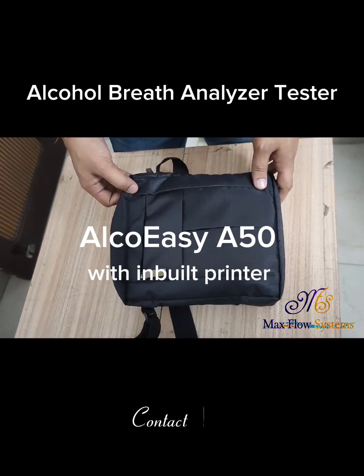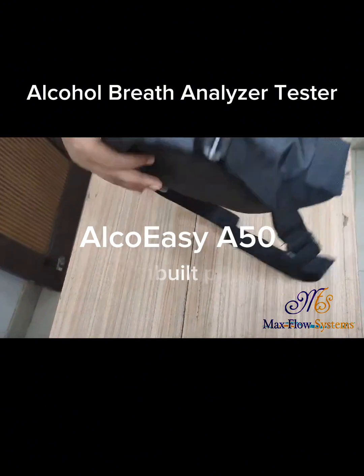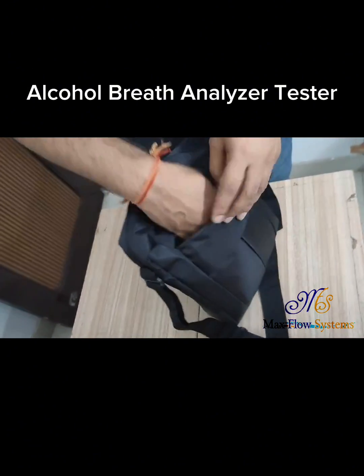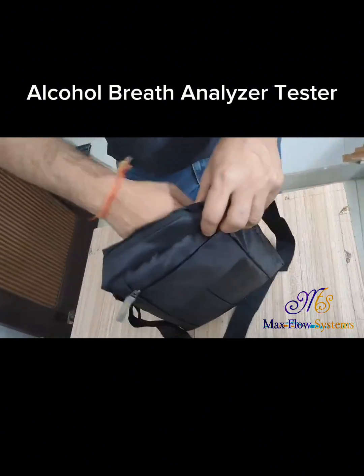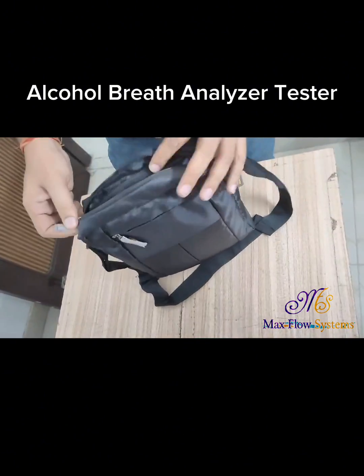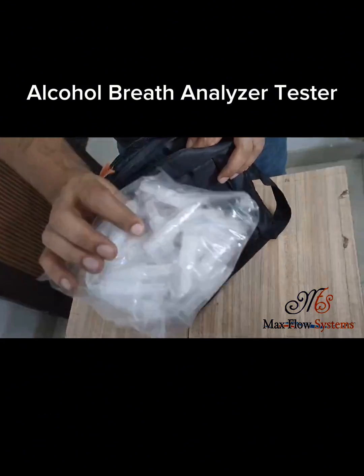This is the alcohol tester, model number A50. It comes with this bag. It consists of a first chain, second chain, and third chain. It also consists of its mouthpiece — 50 mouthpieces.